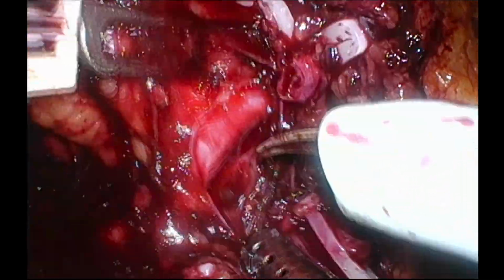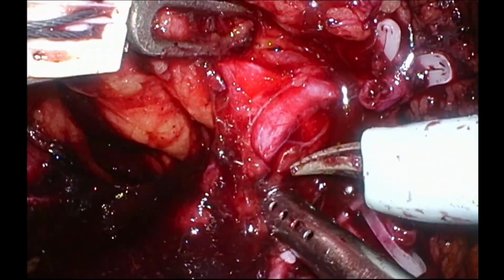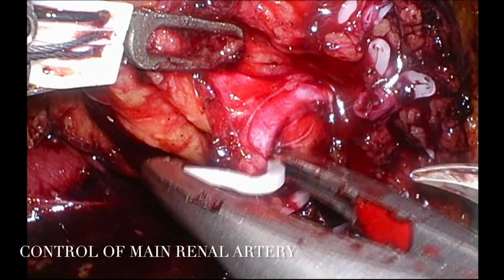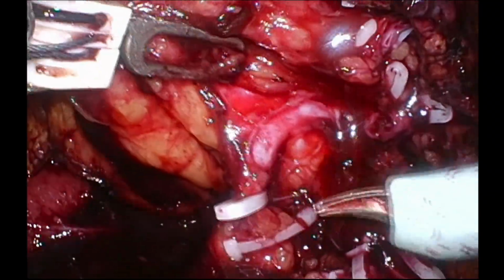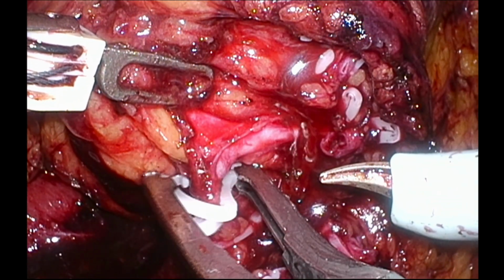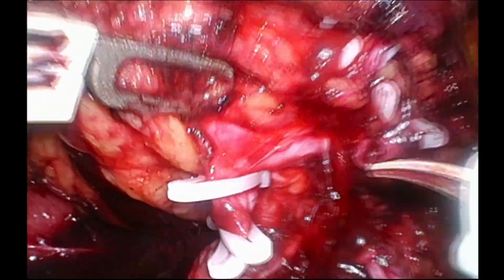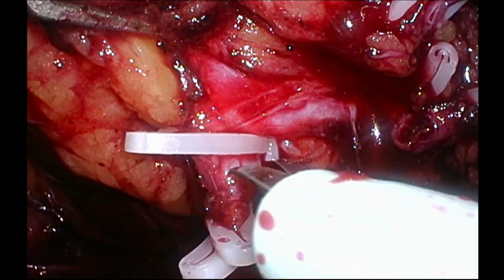The renal artery is skeletonized by careful dissection from the surrounding structures to gain adequate length for clip applications. Renal artery is divided between the proximal and distal clips.